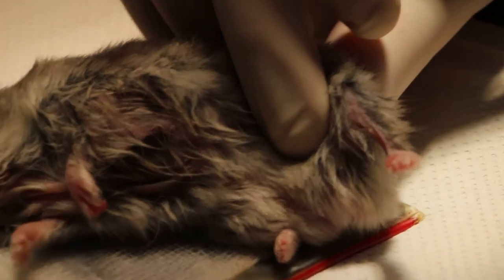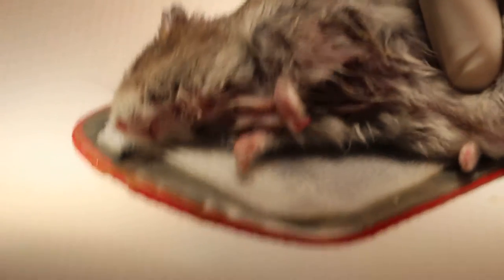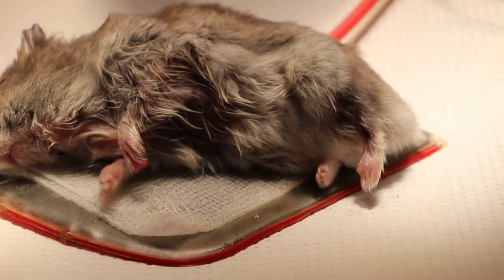Okay, ready? January 13, 2014. Electrosurgery ready. Which one? Yeah, we have one first. Okay, nice. The back one. Yeah, we have one first.